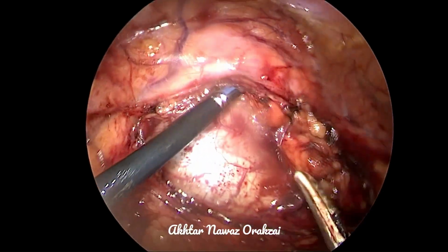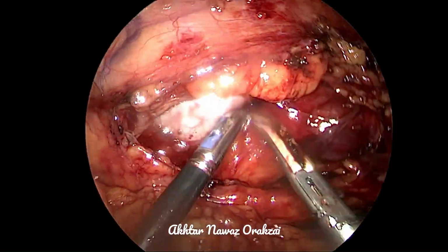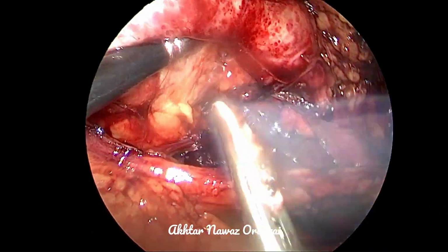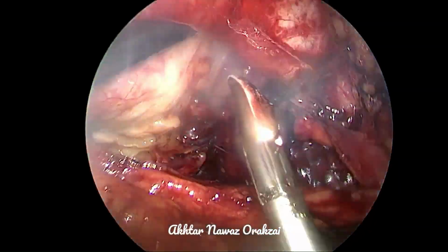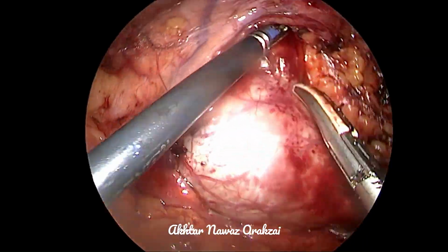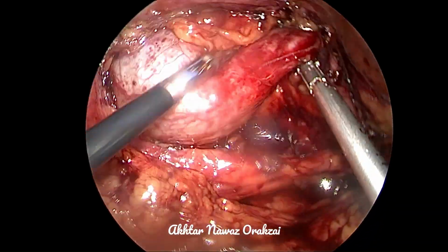Care must be taken not to miss any crossing vessel, because injury at this level can be expected if there is a crossing vessel. However, in this case, a congenital adynamic segment seemed to be the cause, rather than external compression by crossing vessels. I'm not using the word aberrant vessel because it is not an aberrant vessel. It is basically a normal vessel which has divided early, leading to an abnormal course of the artery.